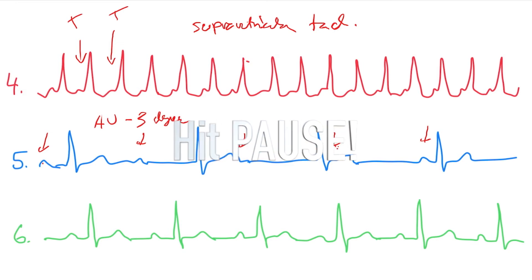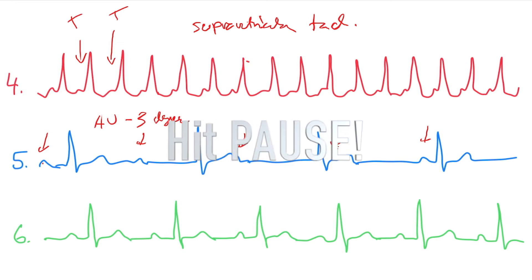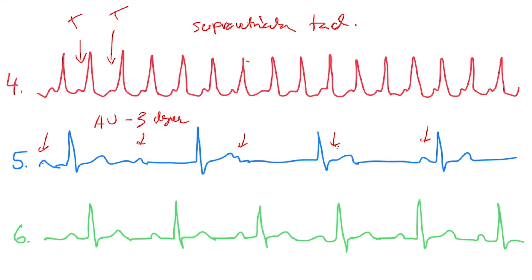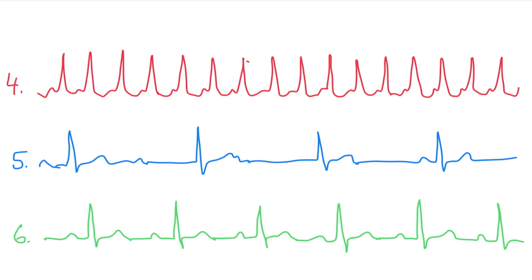Look at this. Six. What is that? This is hard to tell, but I'll tell you — this is elongated everywhere, constantly. PQ is longer. So it's an AV block. Which degree? First. The first degree. Very good.